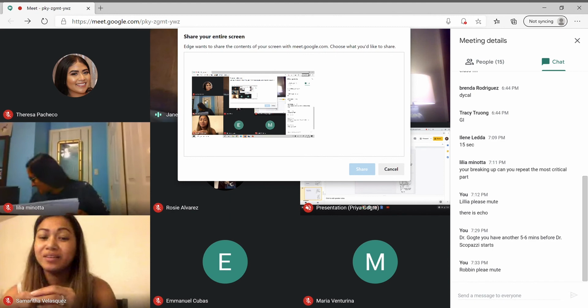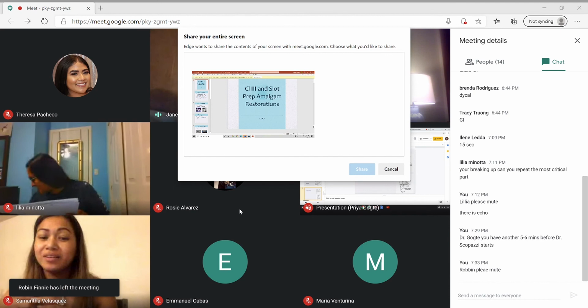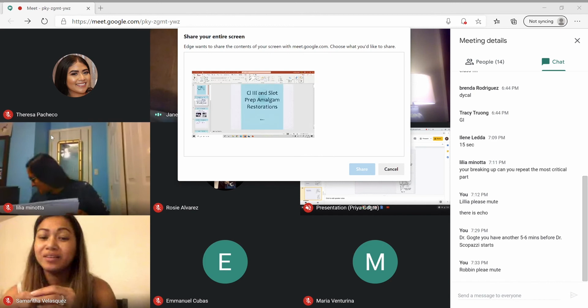The difference from a composite to an amalgam is that when you pack an amalgam, you cannot use the clear matrix system that you use with a composite, because you need to burnish and pack against that matrix system. You will need a wedge, and you will need a Tofflemire and the matrix band around it.